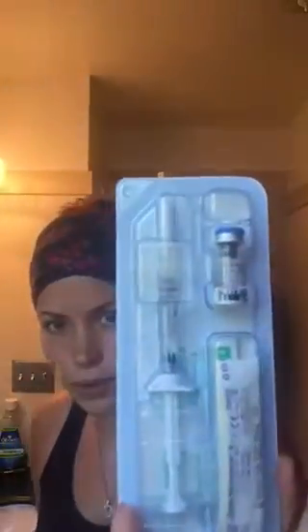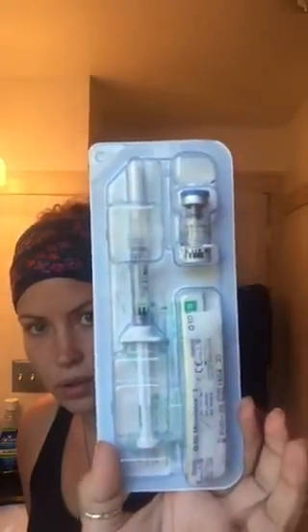These are really easy. They come preloaded and you just have to put on the mixing needle. They come with an alcohol swab, and then you mix it in with a little powder. The sterile solution is already in the needle.